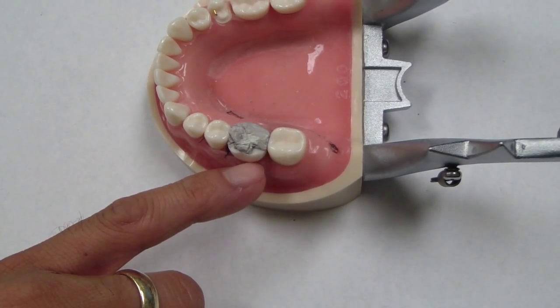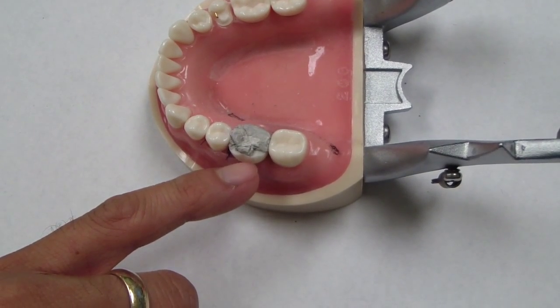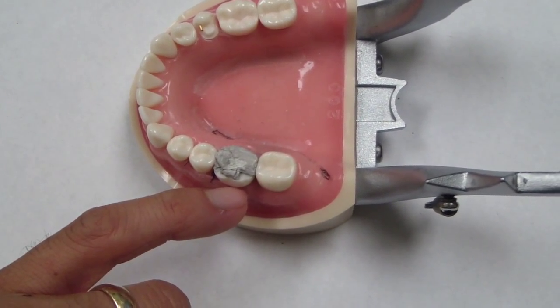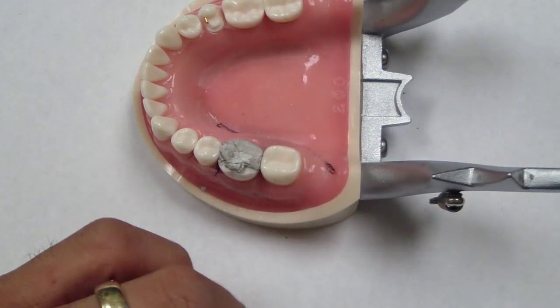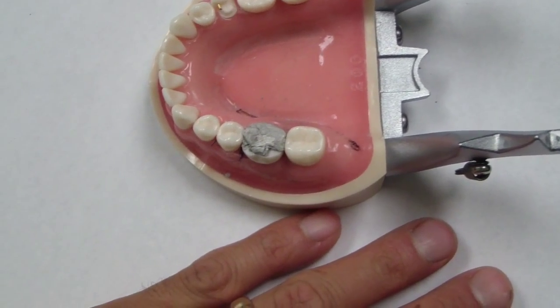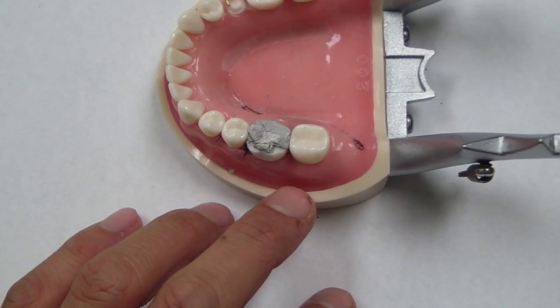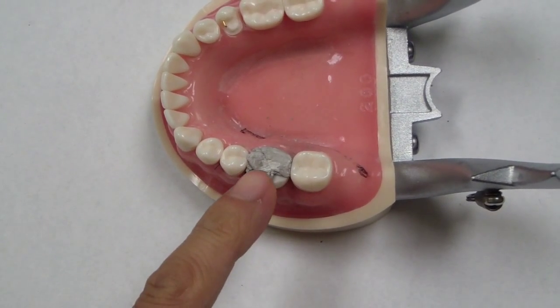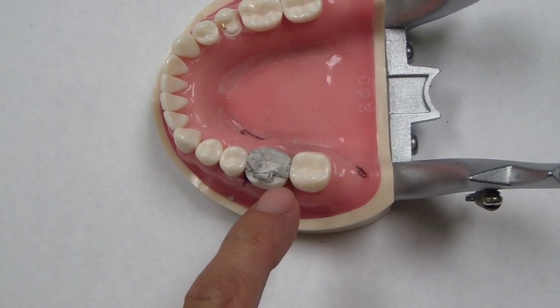If you remove this amalgam and you're going to place another amalgam restoration, you have to take it out and then place some sort of band, whether it be a Tofflemire, automatrix, or any other type. Then pack the amalgam restoration and let it set for approximately 24 hours. We all know that as these restorations get larger they become more and more difficult — and this also applies when you're replacing this restoration with another foundation restoration out of amalgam.